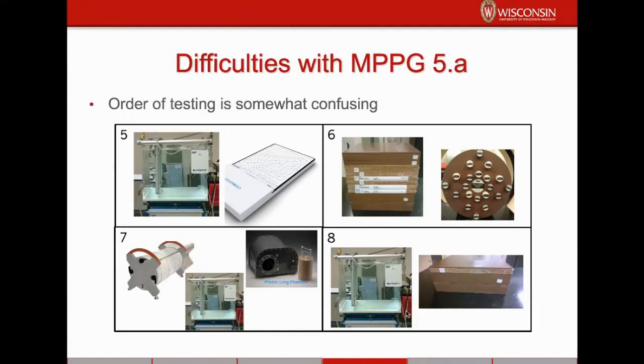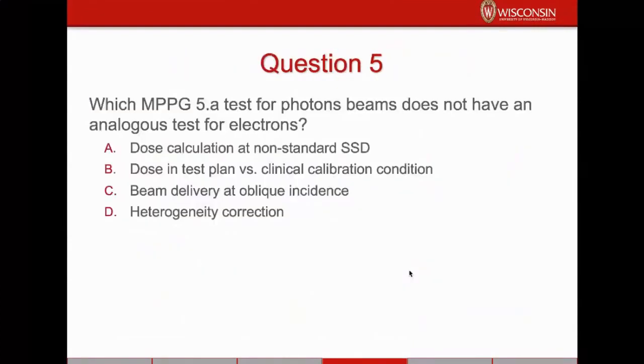And from a commissioning standpoint, what we really want to do is set up our equipment once, use it for all of the tests that require that equipment, and then put that equipment away and not need it again. That's the most efficient thing to do. And so when you're preparing for your tests, make sure that you're mindful of the order of testing and that you do things as efficiently as possible.